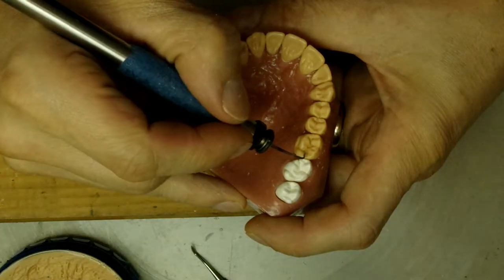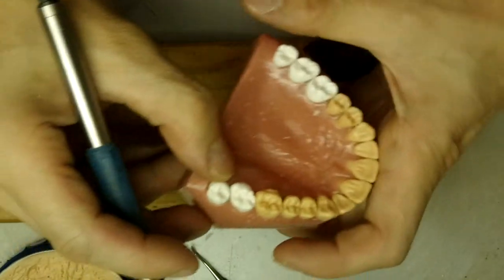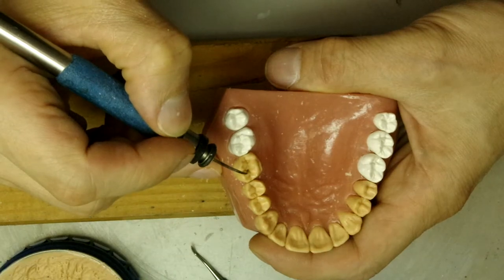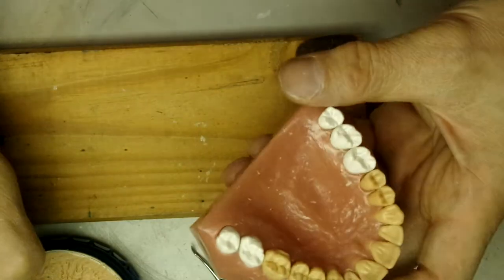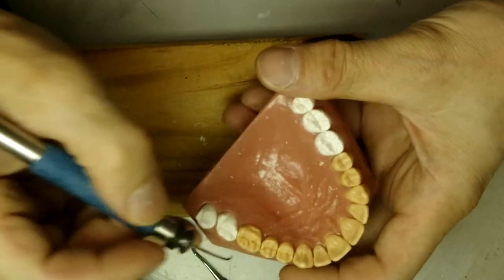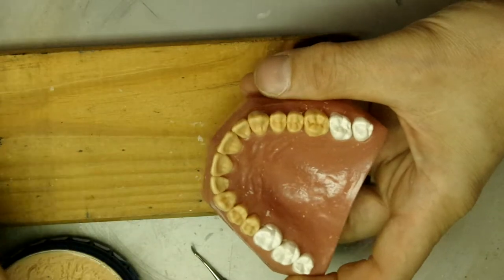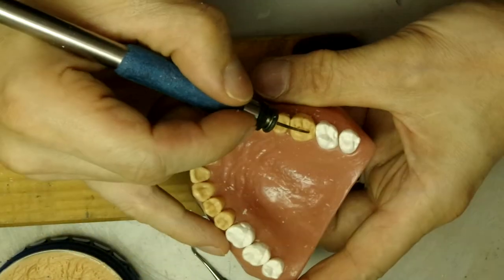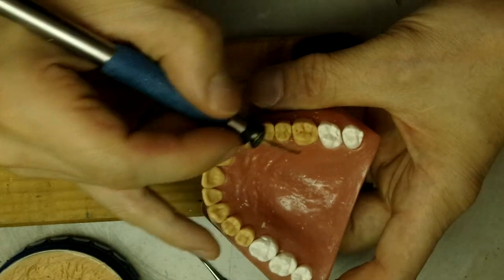Let's add some wax here. We'll add some wax to the mesio-buccal triangular ridge - I don't know why I keep saying marginal. We'll make a little secondary depression there, puddle in this little groove here, and make it smoother by the oblique ridge. It's a little open, so fill that in.